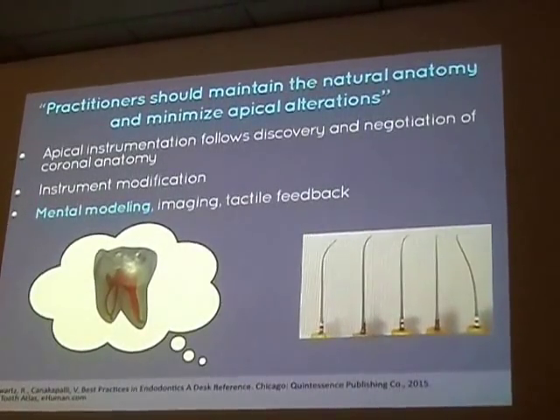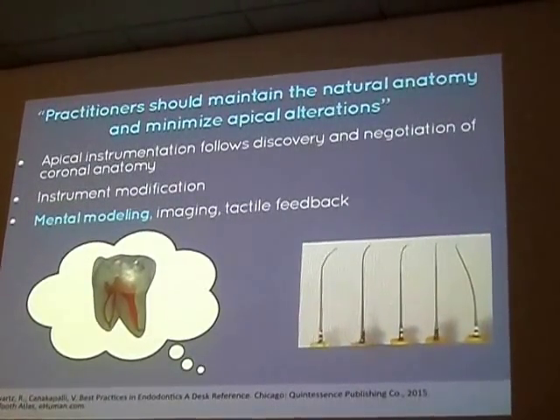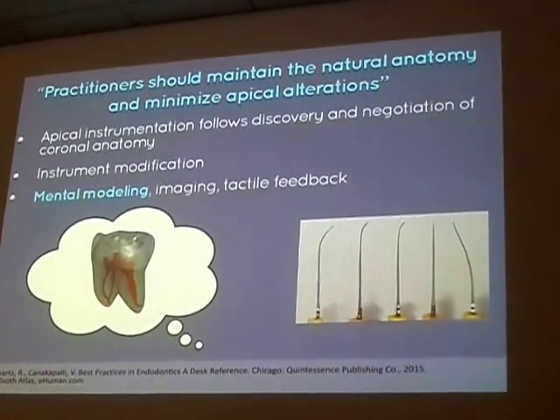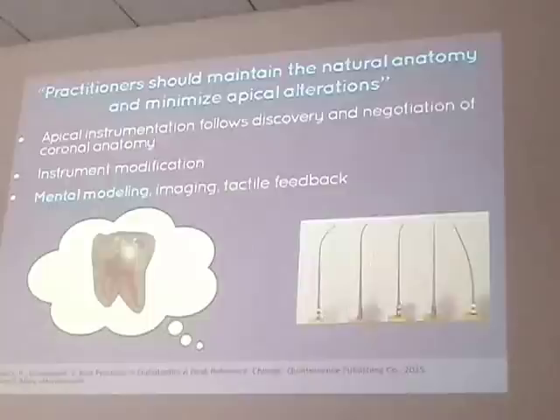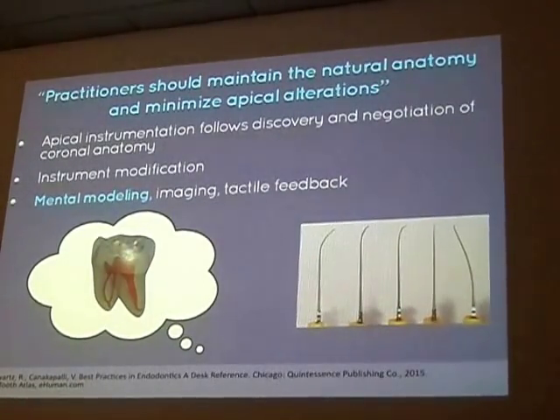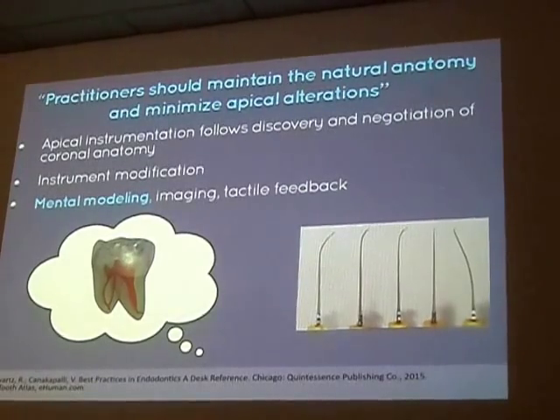And this idea of mental modeling, so perhaps with the use of CBCT, we understand the anatomy of the teeth better than we have before. So really having this mental picture of the tooth before you even start instrumenting.